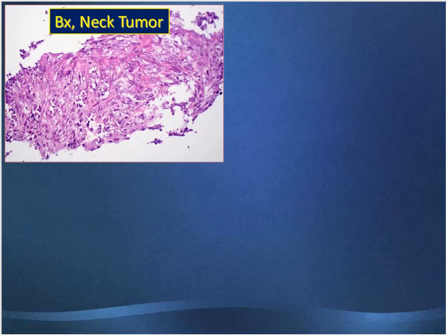Sometimes you're dealing with a small biopsy, such as this neck tumor in a patient who already has a diagnosis of vascular malignancy of known nature that came to us with this particular tumor, which was not very well preserved. And I can tell you that when dealing with endothelial markers, CD34 is really neither specific nor sensitive enough for this particular tumor.